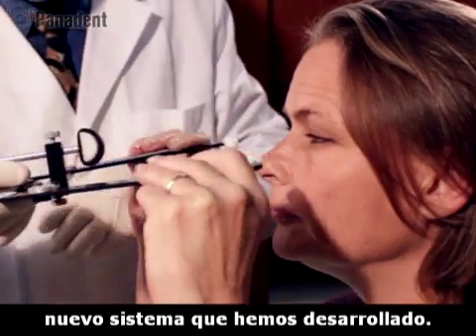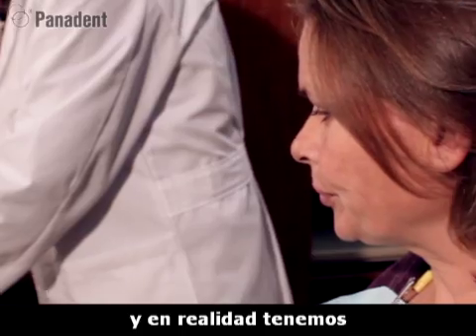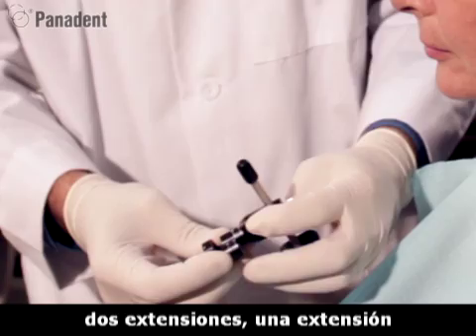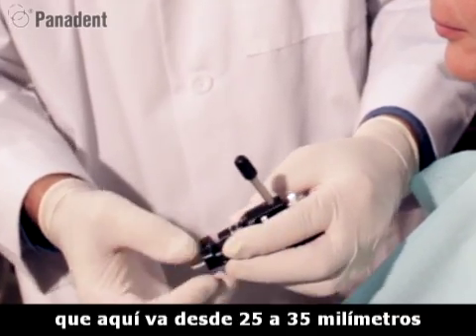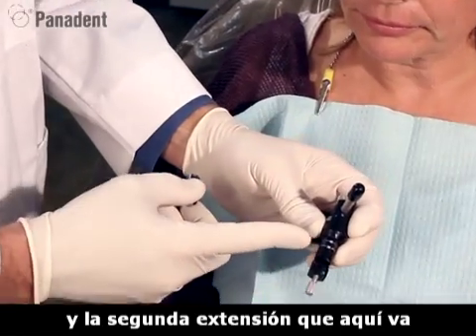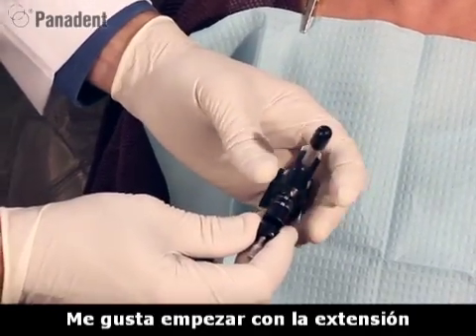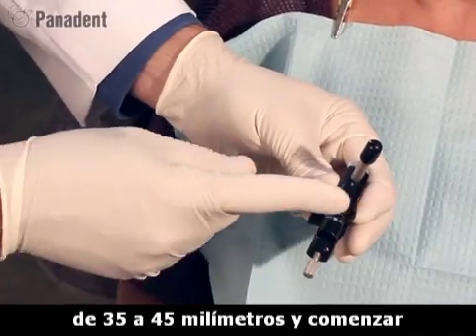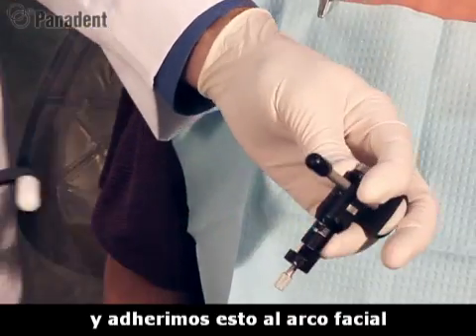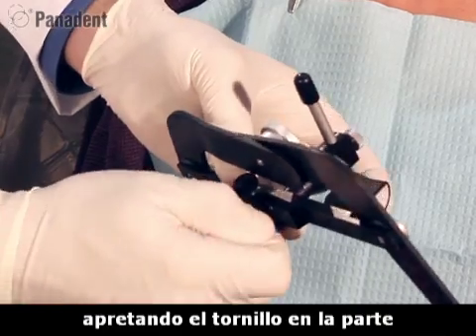I'm going to remove the standard nasion relator and replace it with an adjustable nasion relator. The adjustable nasion relator has two extensions: one extension goes from 25 to 35 millimeters, and the second extension goes from 35 to 45 millimeters. I like to start with the 35 to 45 millimeter extension and start at the 40 millimeter mark. We'll attach this to the face bow by lining it to the slot and tightening the screw on the bottom.